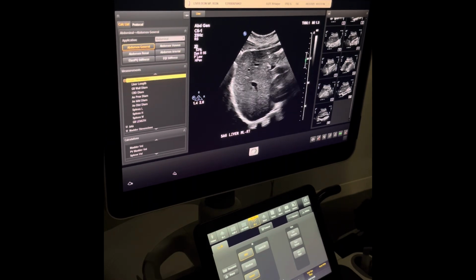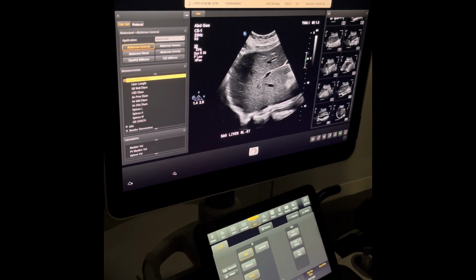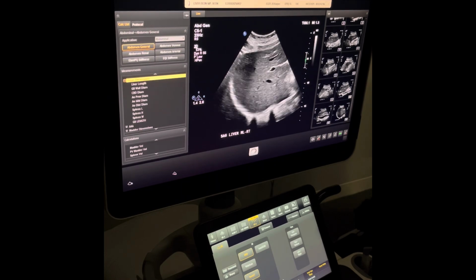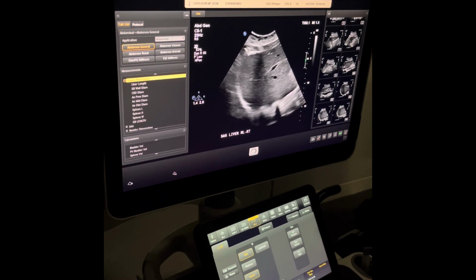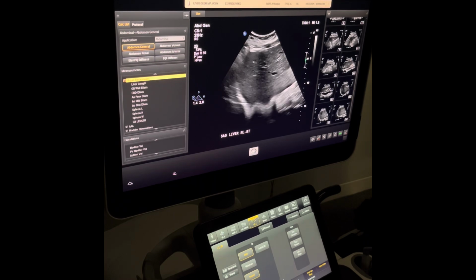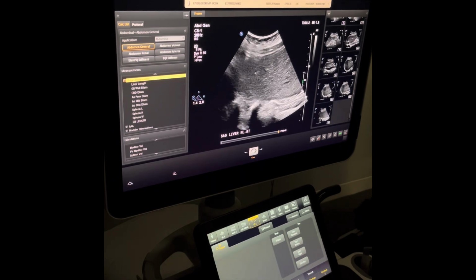Then from there, I'm going to sweep out to the level of our main lobar fissure. And then continuing on out until we're out of it completely. Every 2 centimeters, taking an image until we've swiped out quite far. So I'll have this be my last image. Breathe.